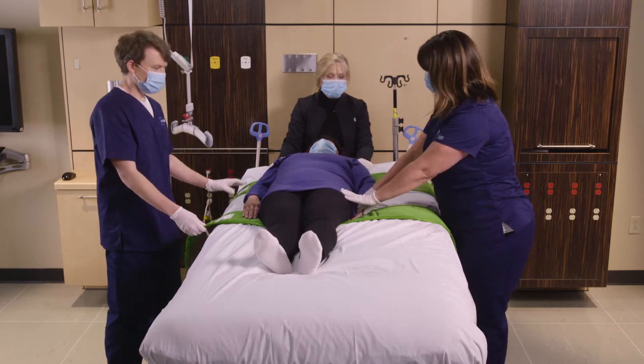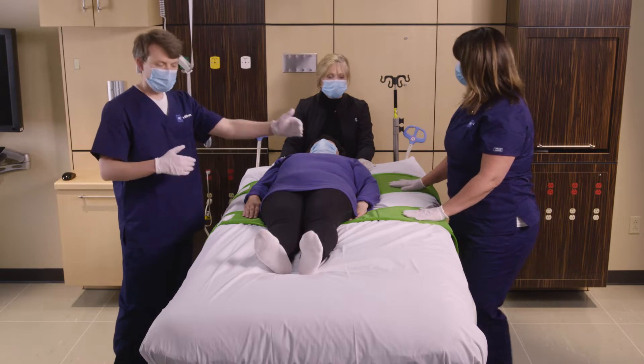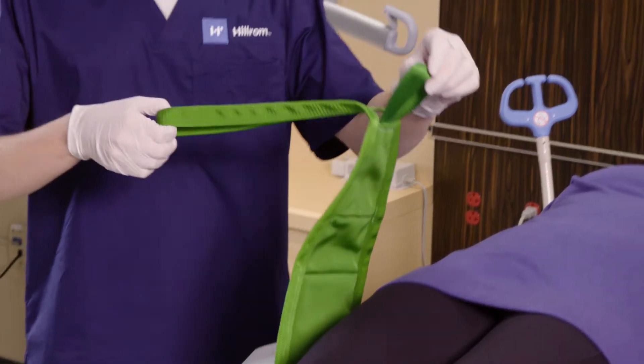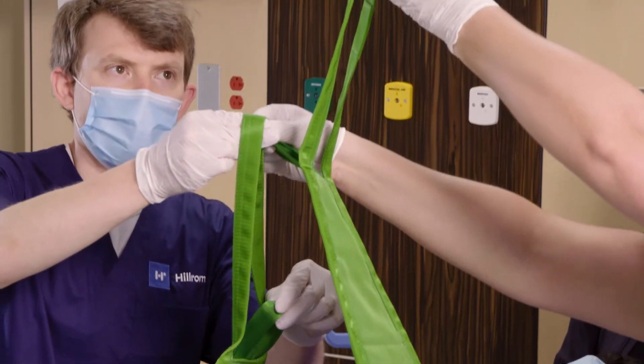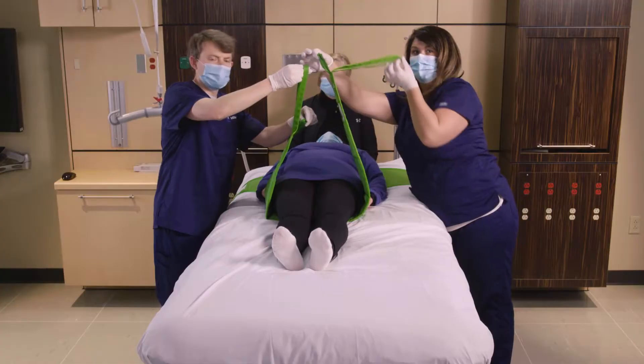We are going to have a short and a long side on the multi-straps. We're placing them off-center, which is going to cause the patient to rotate. You can see one side is about at least 12 inches longer than the short end of the strap.